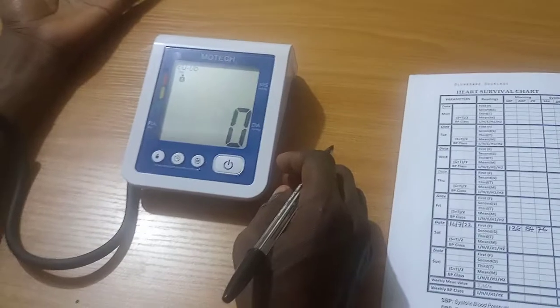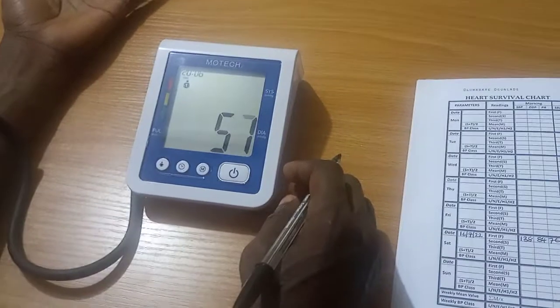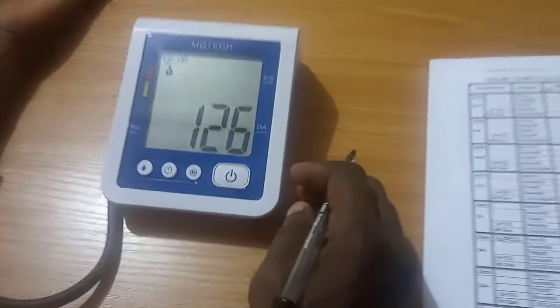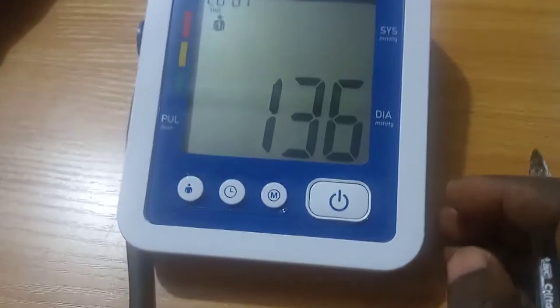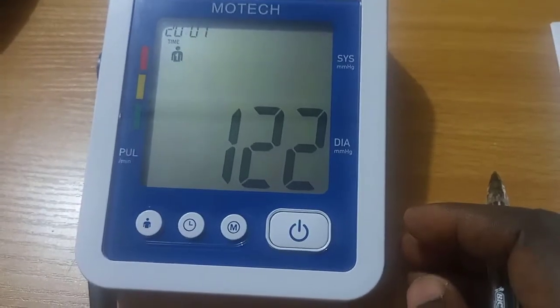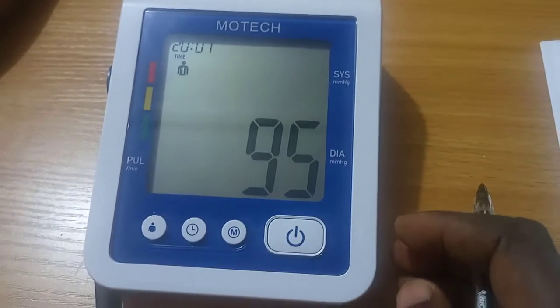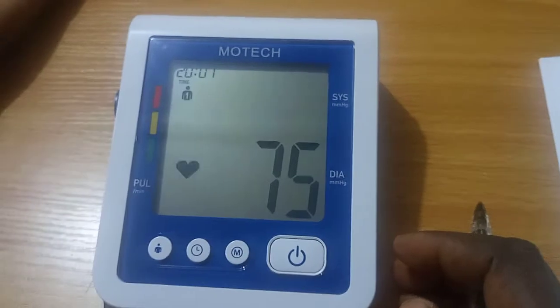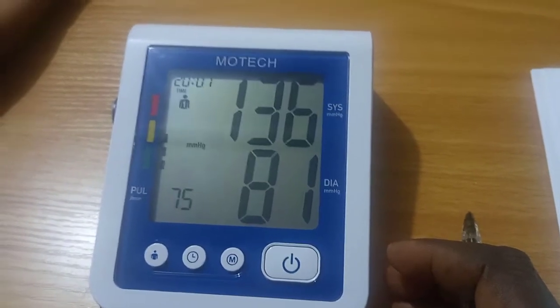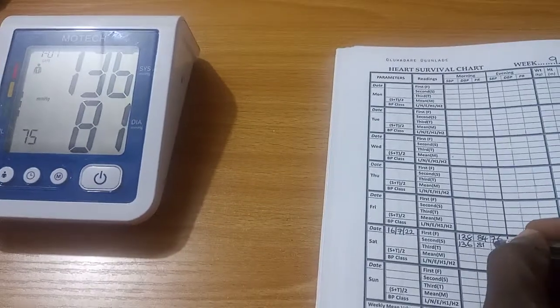The device is ready for use. You may start measuring. Second reading — Systolic: 136 mmHg. Diastolic: 81 mmHg. Heart rate: 75 beats per minute.